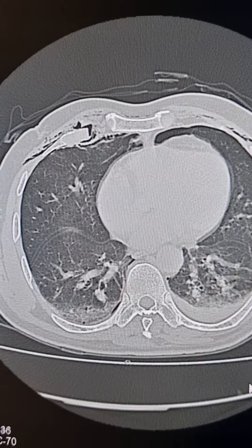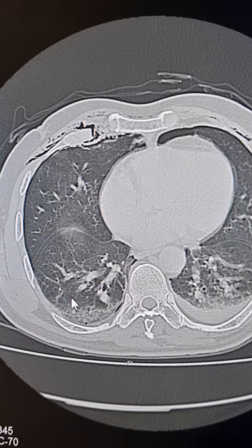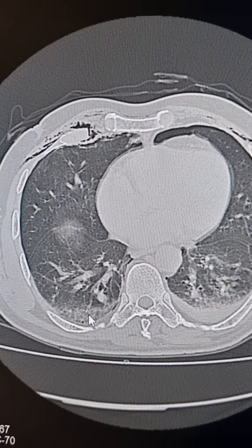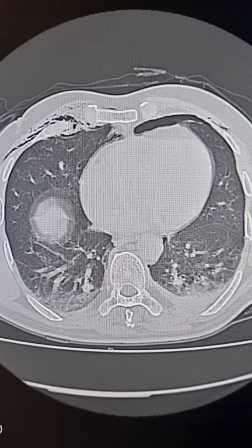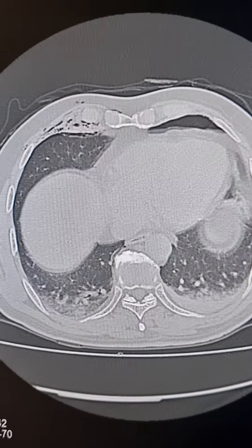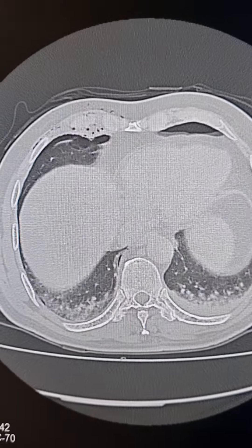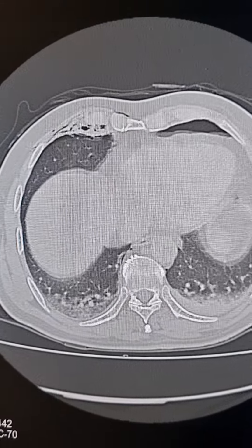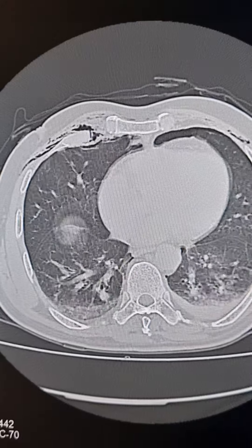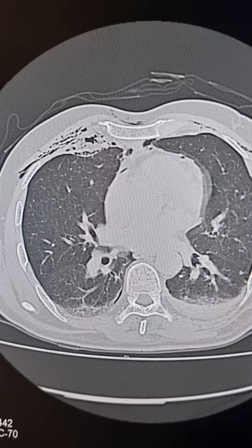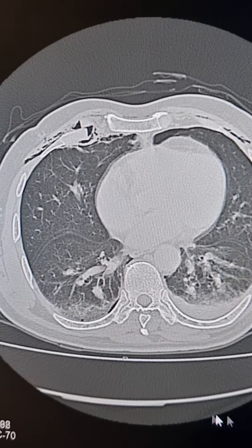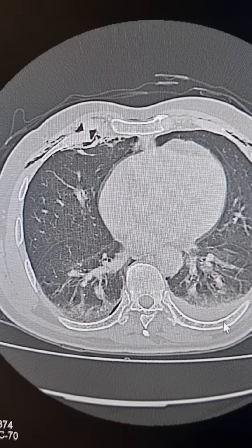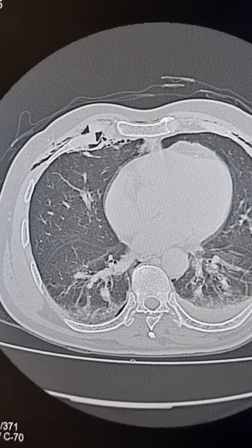There is increased density of lung in the posterior dependent parts of both lower lobes, which is suggestive of effects of hypostasis. There is also pleural effusion on the left side.